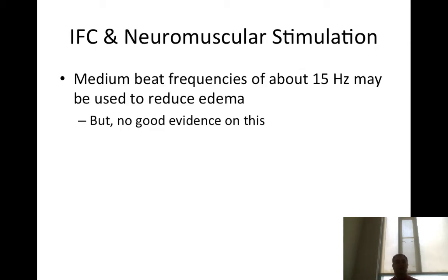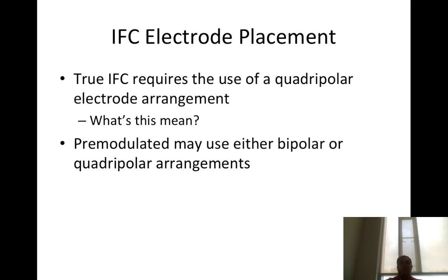Medium beat frequencies and stim reduce edema. No good evidence on this. Don't worry about that. Next. Okay. True interferential current requires the use of a quadripolar electrode arrangement. What does this mean? 4-pad. 4-pad placement.